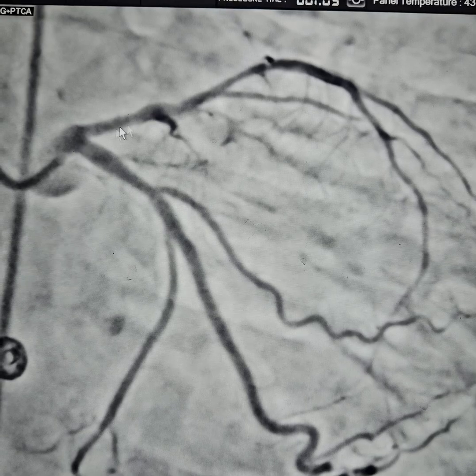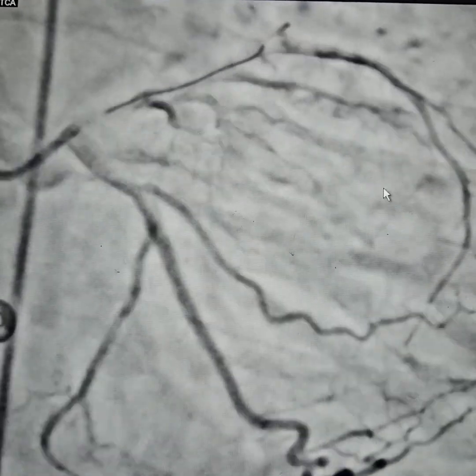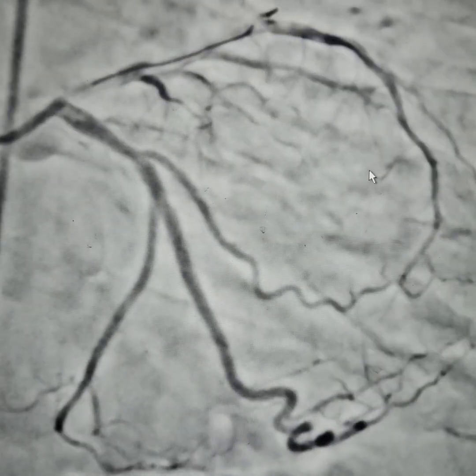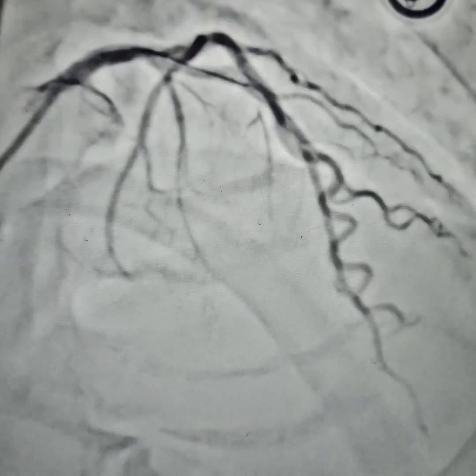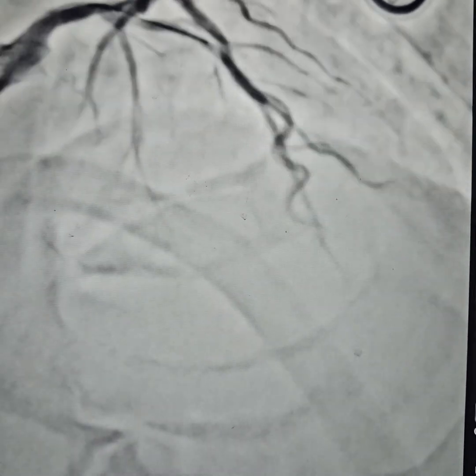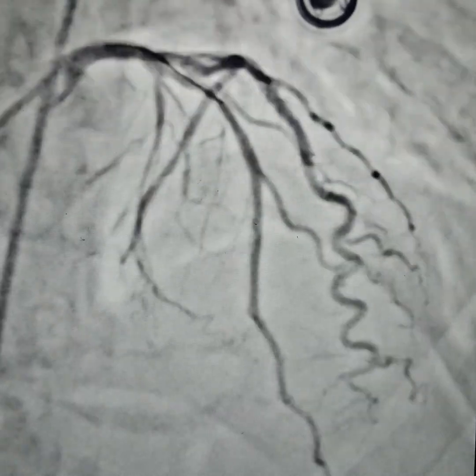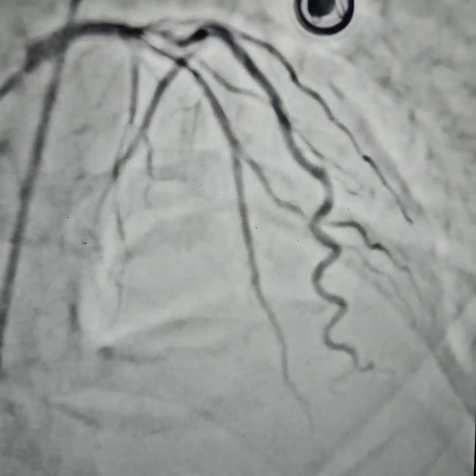Here is the very tight lesion — the LAD has diffuse disease. So we wired the vessel. Measuring is very important. During the angiogram we thought the LAD would require probably two stents, but that is the beauty of measuring — we realized we could do it in one long stent, which also decreases cost for the patient and has a good clinical effect.